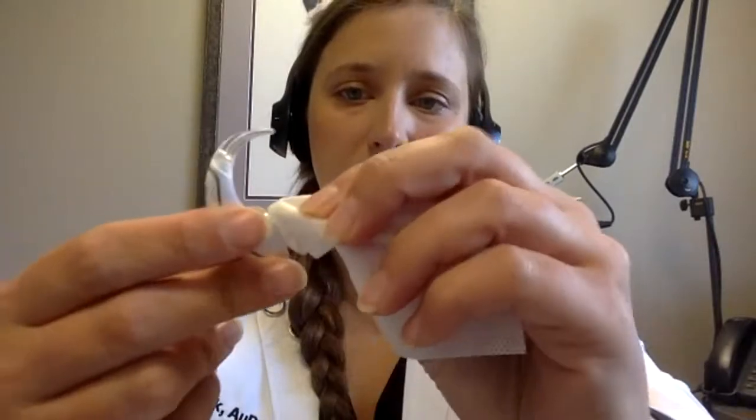Okay, got in-ear monitors, hearing aids, earplugs. Okay, let's move on to implants. With your cochlear implant, if it goes totally dead, go ahead, take off your battery, try a new one, right? We can also get moisture on these contacts too. We talked about that last time. So if they really stop working, go ahead and use this combination again to clean off the contacts here. If it's still not working, it could be your little microphone covers up here.